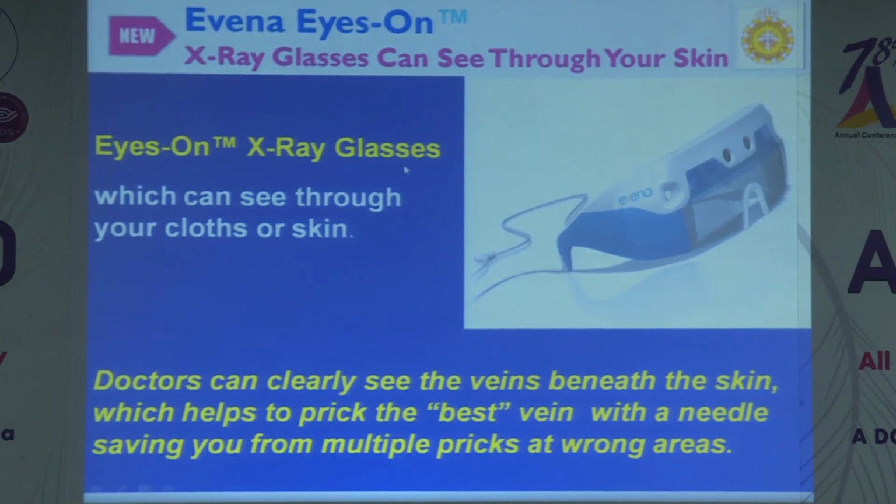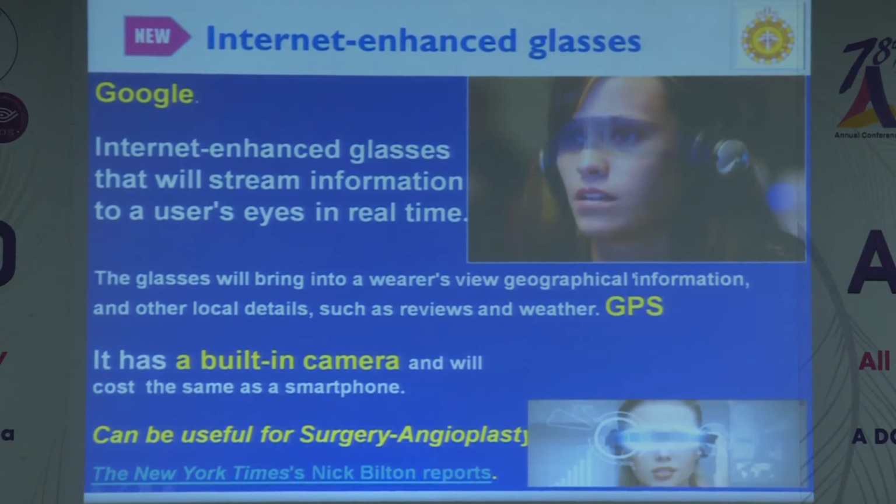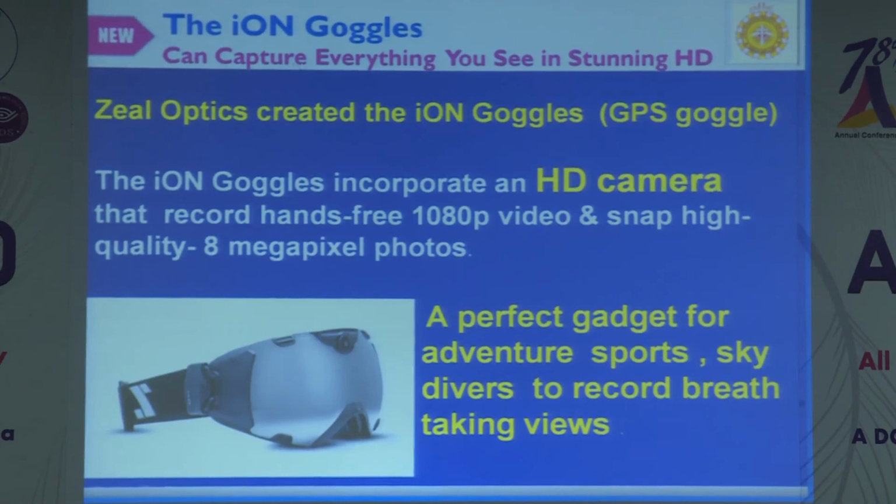So for doctors it is ideal to take the IV line. That type of spectacle is available. There's also an internet-enhanced spectacle, connected to the GPS and everything. That is better for driving, with a built-in camera. That is also useful for angioplasty. Now a spectacle with an HD camera is also available. That's a perfect gadget for adventure sports, skydivers, etc. So digital photography during adventure sports is also available.